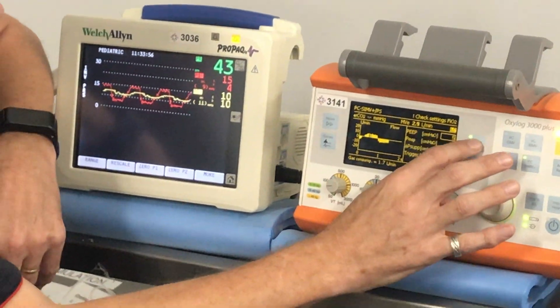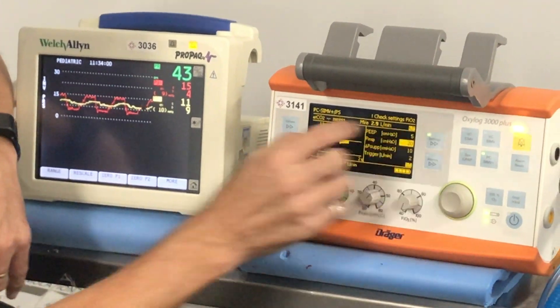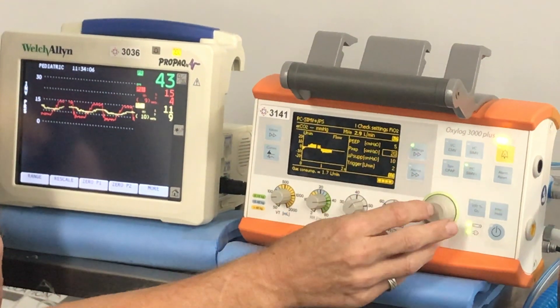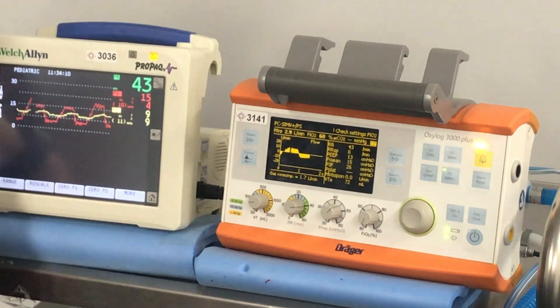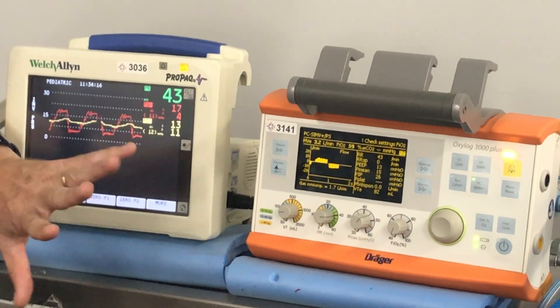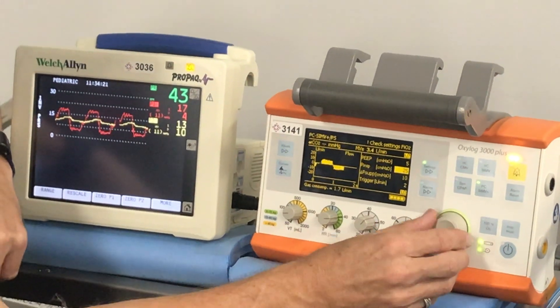So if we go through — we've currently got a PIP of 20. Let's look at our tidal volume: it's just below 70. We're going to change that up to 25. We've increased it from just below 70 to about 80 — so it's a slight improvement, but it hasn't really done a lot. We'll put that back.